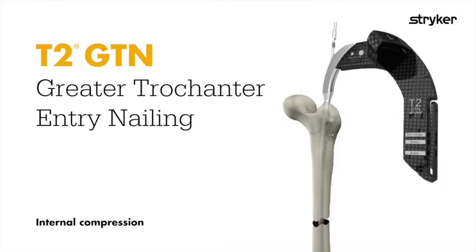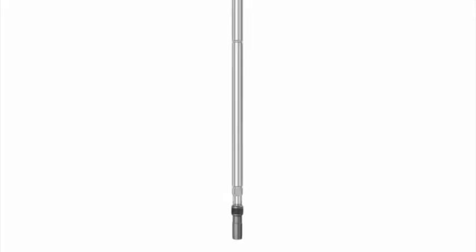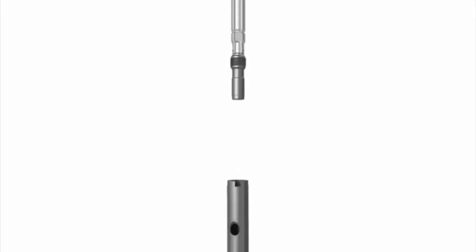The cannulated compression screw allows for up to 10 millimeters of active internal compression. To use, preload the compression screw in the nail before attachment to the targeter.